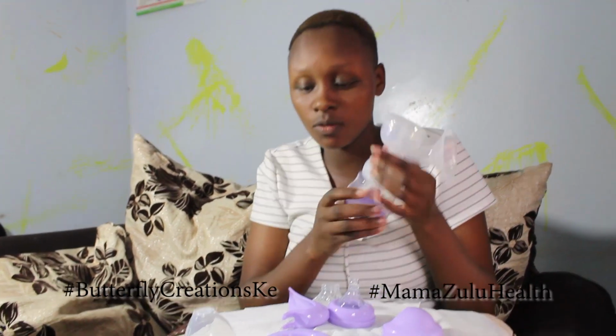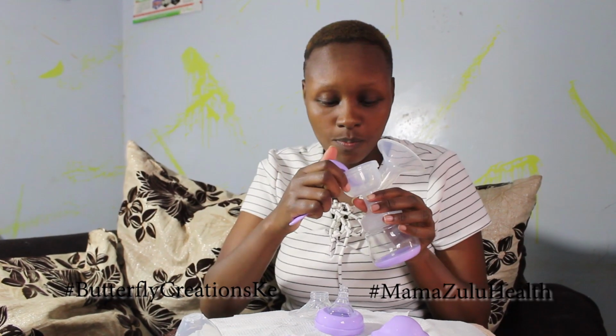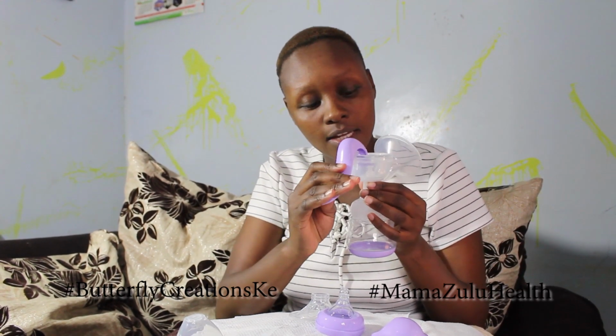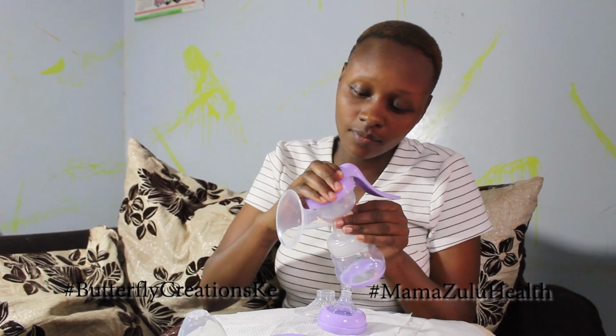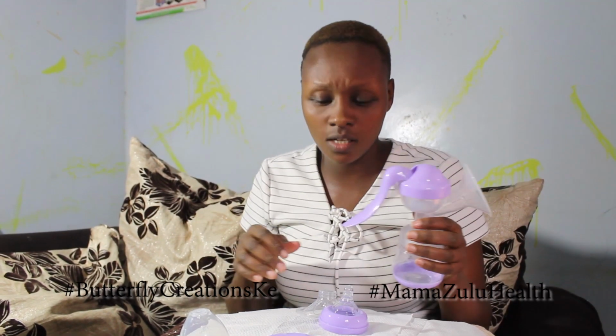So you rotate until you hear that there is no other movement allowed. So that is it. Even when you try pulling it out, it doesn't come out, so you know it's fitting well. Then this one is what you use to pump. So you place it here nicely like that. You can feel this, and then just to make sure it's completely secure and it won't come out when you're pumping, because you have to apply some pressure. So you secure with this like that. Make sure it's firm, that it doesn't come out, because it's very uncomfortable when you're in the middle of it and then everything just comes out.